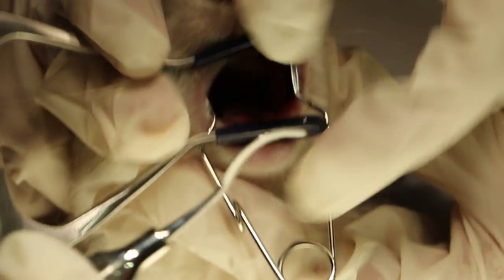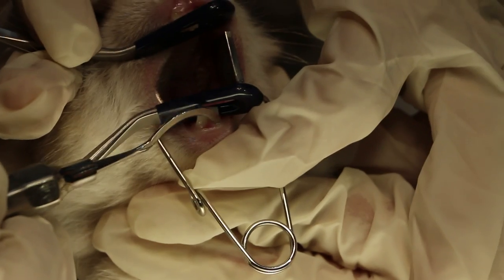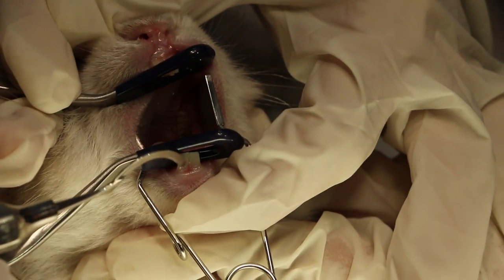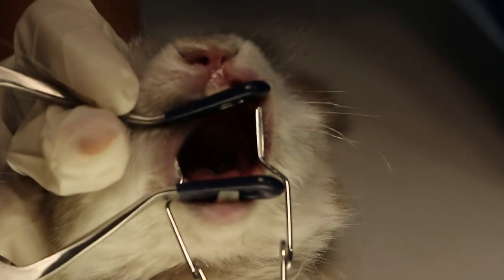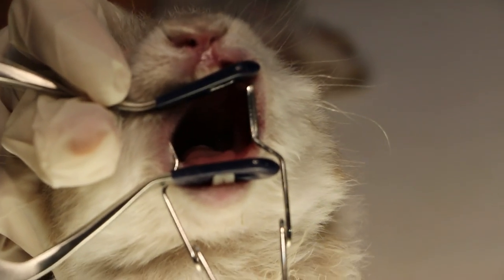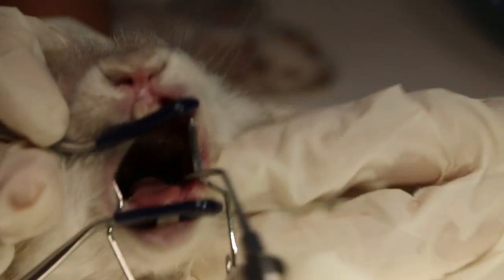This upper one is the incisor luxator for the upper front teeth, and that is the lower one. The molar luxator goes in to open the cheek pouch wider and loosen the ligament of the molar.